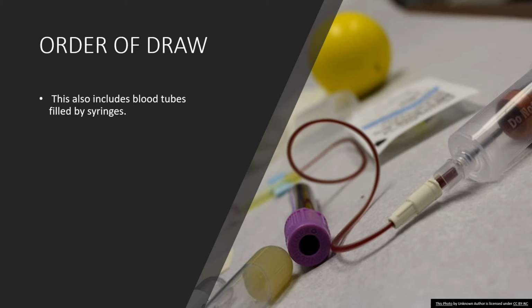But to stick on the realm of order of draw, it's not just when you're drawing blood with an evacuated tube system that order of draw is important. Okay, when you're using what we saw from our previous slide, that evacuated tube system, you want to make sure that you perform order of draw.